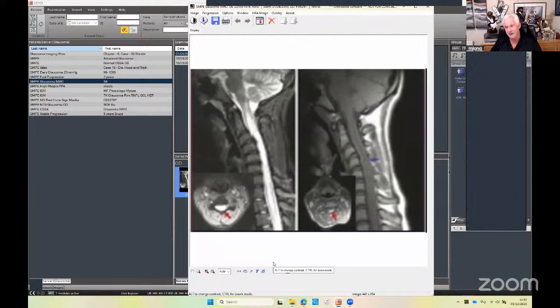I've had a couple of neuro-ophthalmologists tell me that they're not even sure that that's correct either. But the moral of the story is, with your OCT, you could identify that here's a patient who's been on medication for glaucoma since 2001, and this is about 7 years ago now. Didn't know about anything else, but the patterns that you see on your OCT suggest that this is not really a glaucoma problem. It might be something else. That's a very interesting case, and I don't know whether you have any questions about that one, but it shows you what you can see with your OCT if you know what you're looking for.